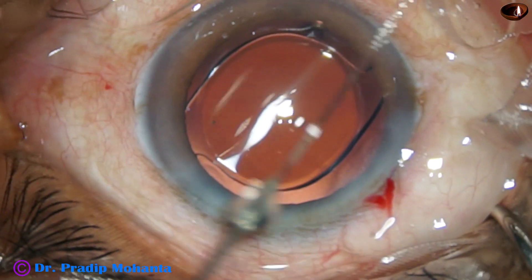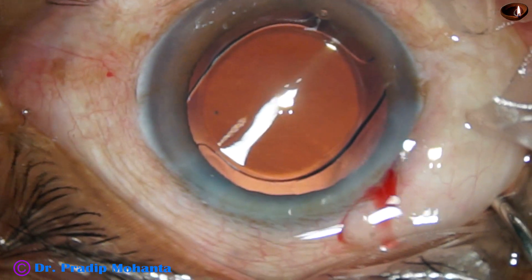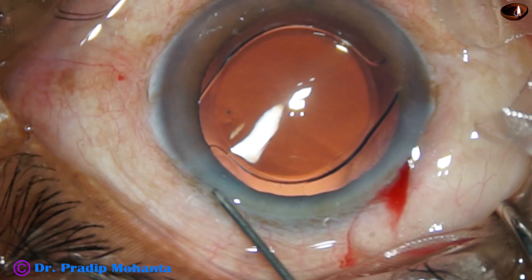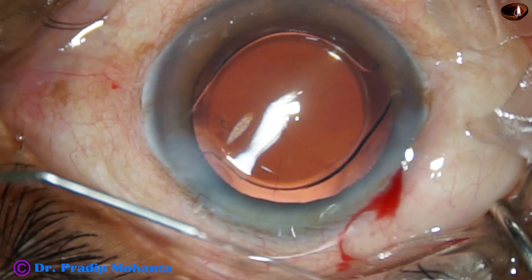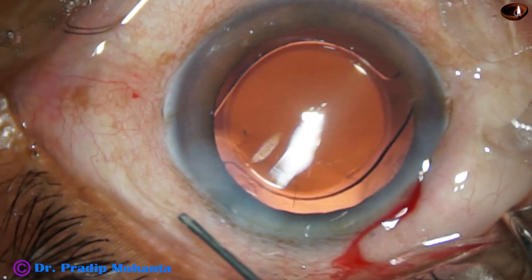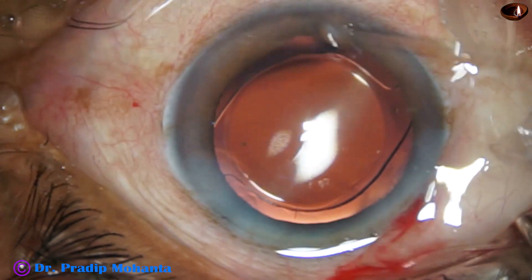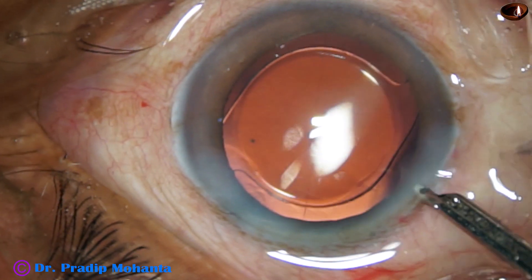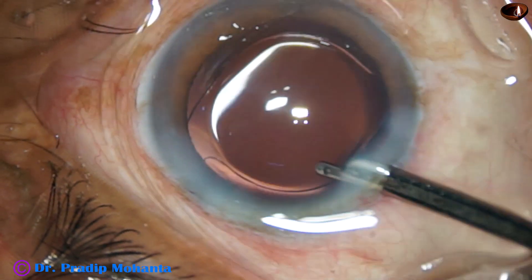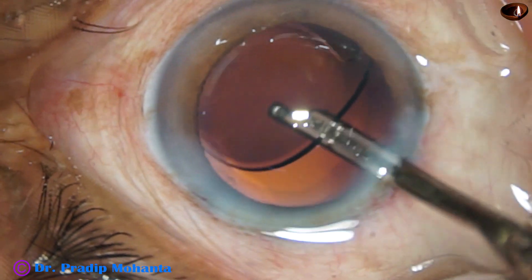And now this is moxifloxacin. The single side port is closed by hydrating the corneal stroma on either side. Now look at the optic of the intraocular lens — it is covered all around by the rhexis margin. So the rhexis was nicely centered and of optimum size, about 5.5 millimeters.